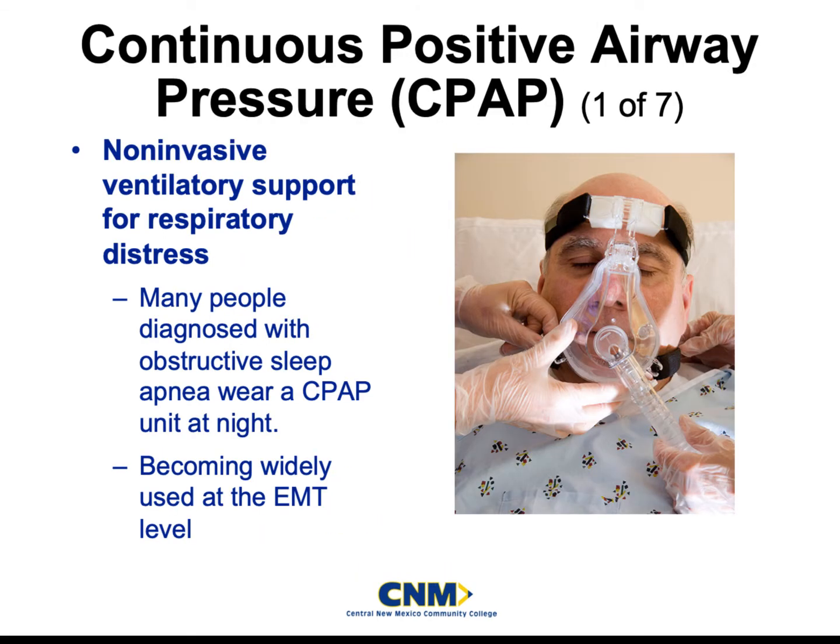Okay, let's talk a little bit about the CPAP. The CPAP was introduced at the basic level, specifically here in Bernalillo County, I want to say about 3 or 4 years ago. This is a great tool for certain patient demographics. This is a very non-invasive procedure.